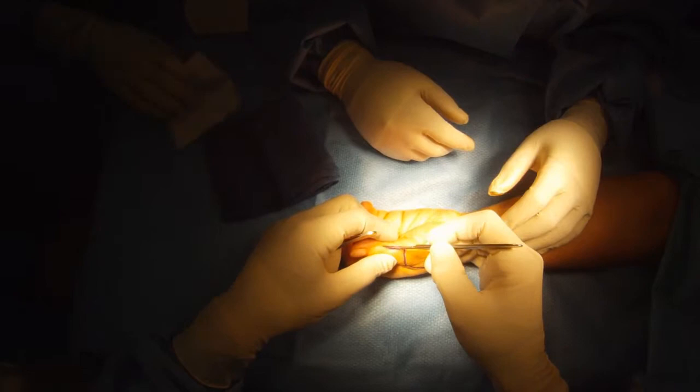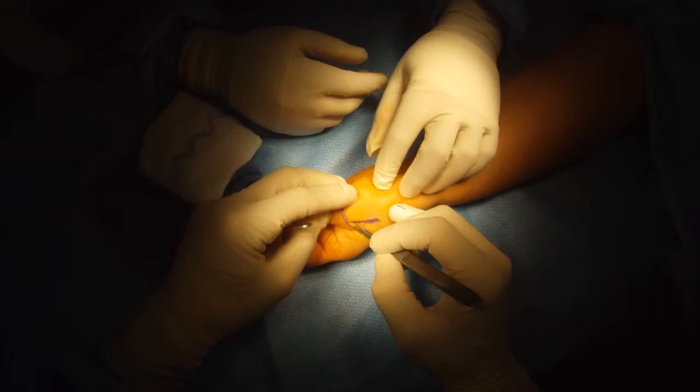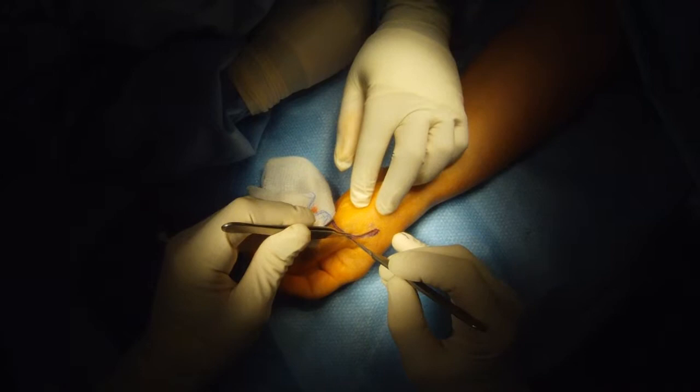Joint Release. This thumb joint, which was stiff, had previously had an extensor tendon repair, which did well, but she developed stiffness. So we're going to release it to regain joint motion. I have to use the previous incision that was made, so I do.